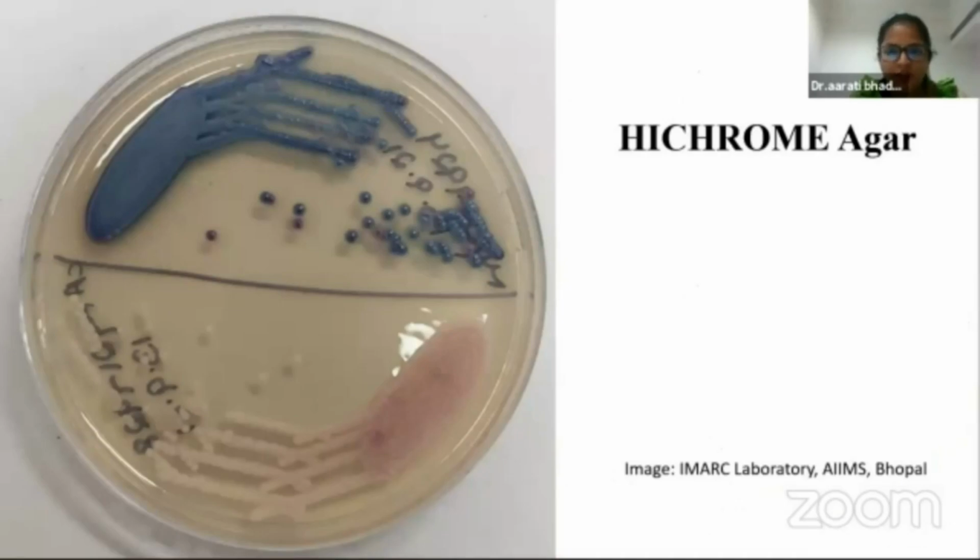Like here, you can see this in our lab only. When we streaked on the chrome agar, two types of colors came. One is purple, one is blue. So this is a mixed culture. If there is any doubt that we are not having Candida only and it is a mixed culture, then we can subculture it on the HiChrome agar and check for the purity.